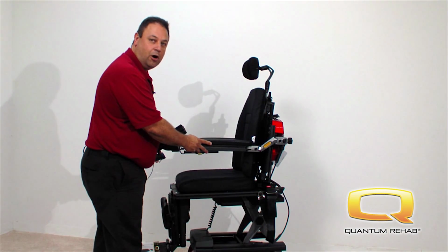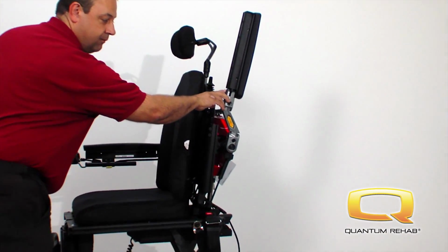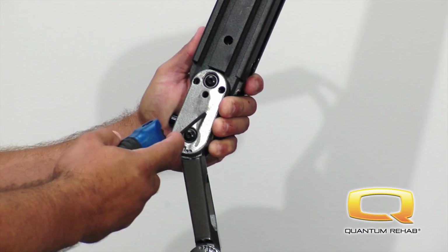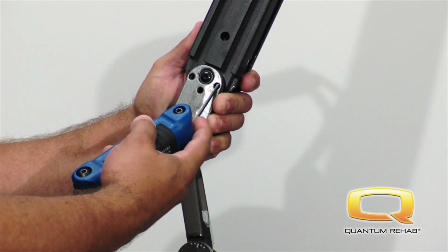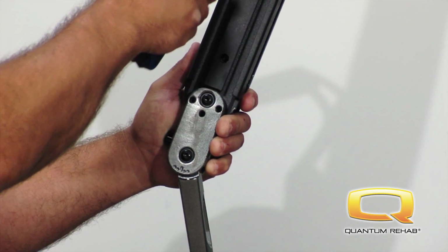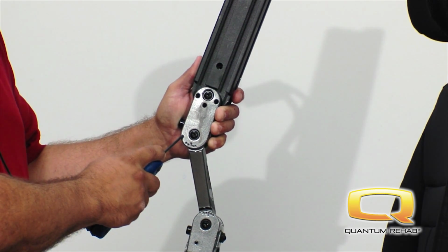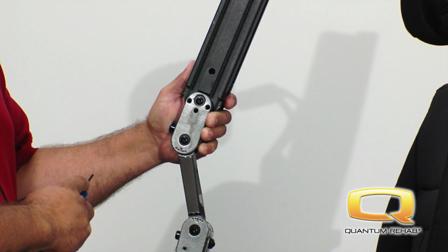Now I would like to talk to you about arm pad adjustment. The arm pad adjustment is located under the arm right here. For your convenience, I've previously taken an arm off so that we can concentrate on these adjustment screws. The arm pad coming from the factory is set with a set screw in this location and in this location, locked down solid. What that will do is give you the arm in total alignment with the arm down here, locked in place with no arm flexibility. If you would like the arm to be flexible both in and out, just loosen this and loosen this screw and the arm will flex in and out accordingly.